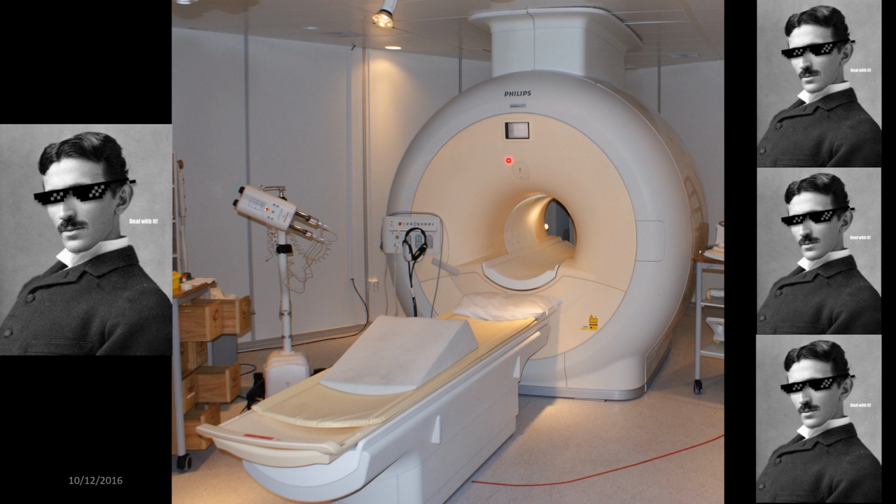The outer portion of the MRI scanner is encased in some insulation, and then it has a vacuum insulator over it as well, because a vacuum is a very poor conductor of thermal energy. And that is sort of your overall view of an MRI scanner. How does it work? Well, how do even magnets work?